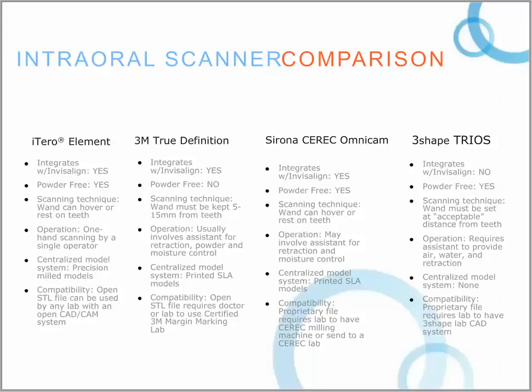And rather than read all of the slide to you, let's just say that Invisalign, you can see, I'm going to run that across the top. Invisalign in the first three is a workflow that is accepted. Trios, others will probably come in the future, but not as yet. Align has not as yet allowed for integration with Invisalign submission. And you have to, again, look at these different features as you start to look at what you may or may not want for an actual scanner. We'll look at, as we go through, some of the other features, and by default, look at what might be features that may or may not be as important as other features.